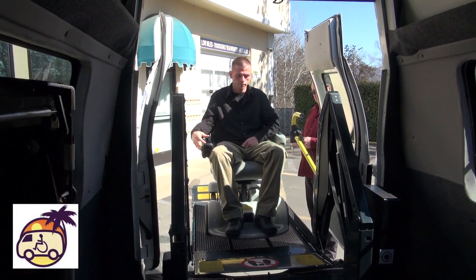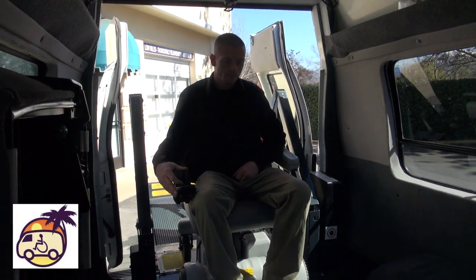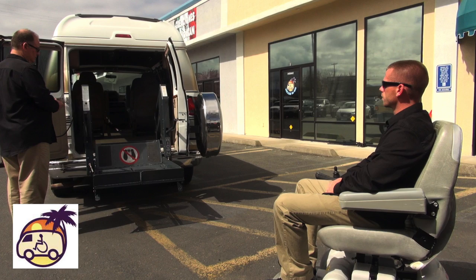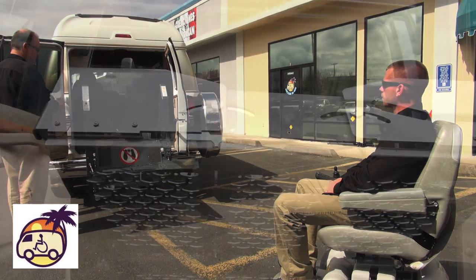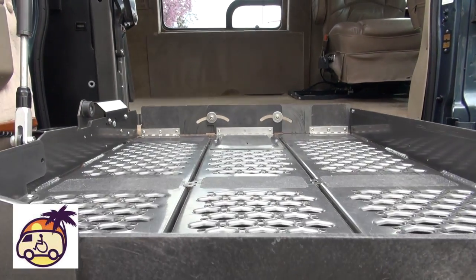In addition to the two styles of platforms I mentioned, which affects weight capacity, there are also two distinctly different categories of lifts. Some have two upright posts or arms that support and move the platform up and down, and some have just one arm which has the platform suspended from it.